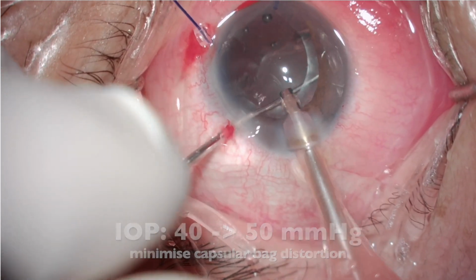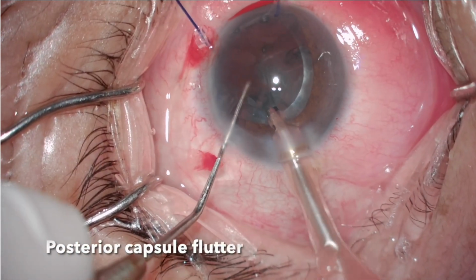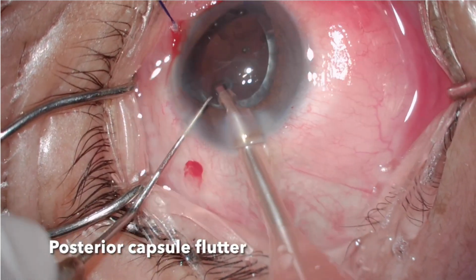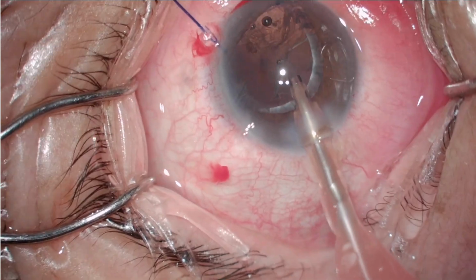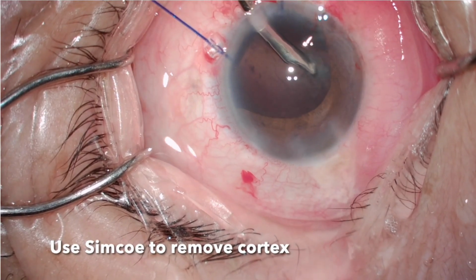There is posterior capsule flutter noted at the weak zonules area. During phacoemulsification, there is excellent flowability. That means vitreous is not clogging the phaco tip. After removing the cortical material, I fill the capsular bag with OVD for capsular tension ring insertion. The timing of the capsular tension ring is as soon as you need, as late as possible.